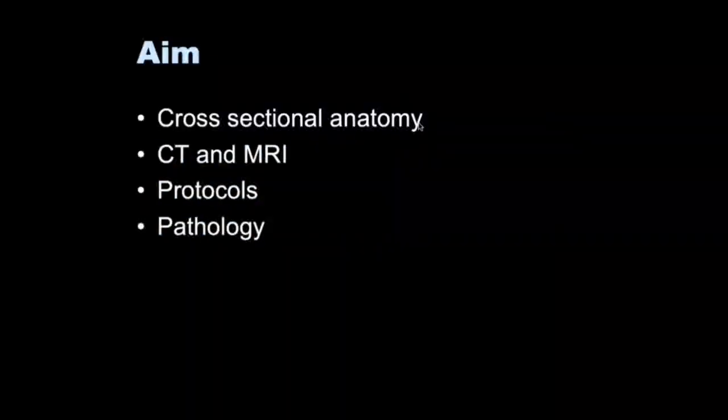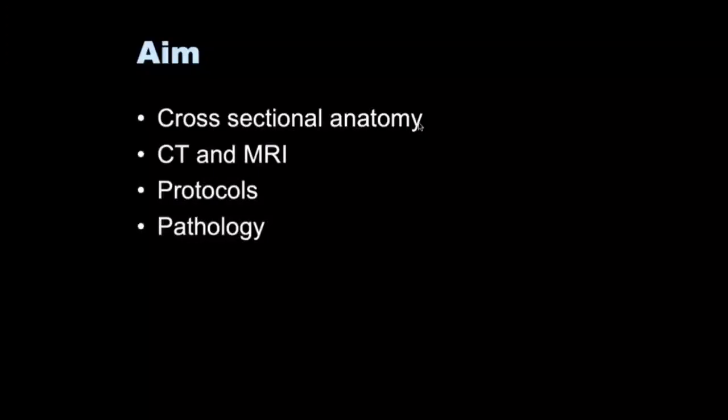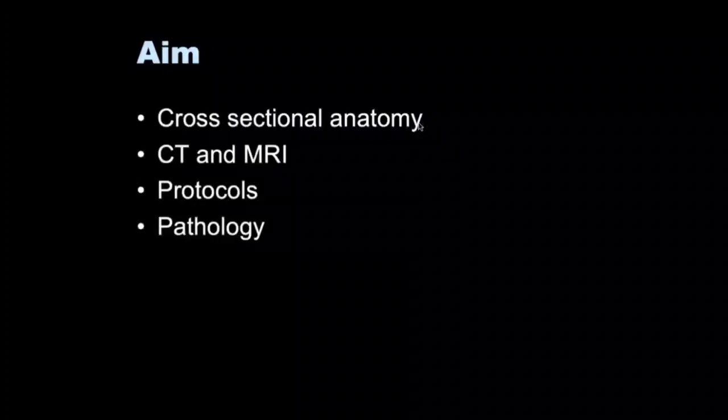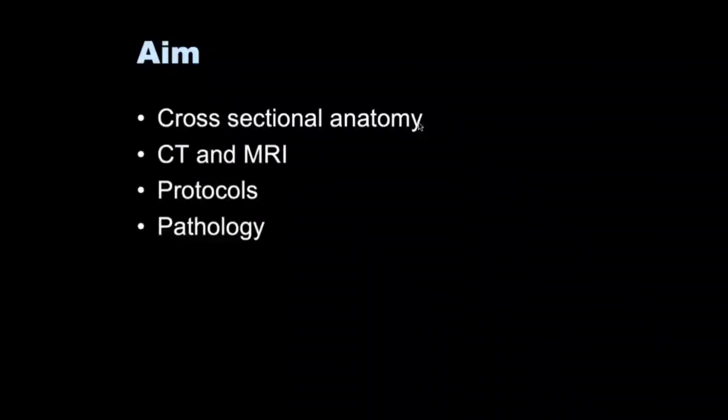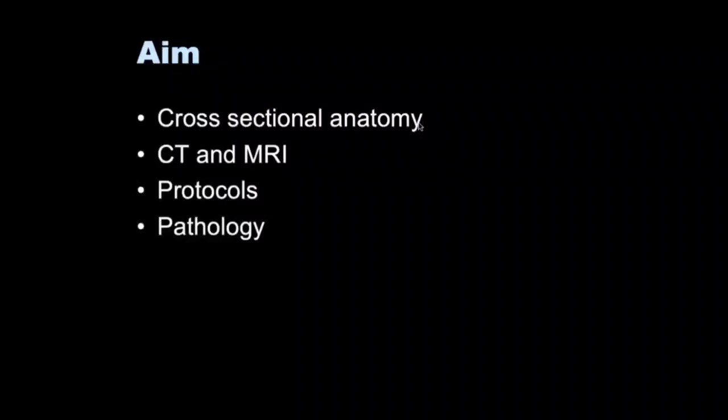I have nothing to declare, and in the next, say, about 30 to 40 minutes, we will be going through the cross-sectional anatomy of the spine, the various appearances of the CT and the MRI. We'll also be touching on the protocols, and then we'll be diving into pathology. Now, I do understand that there is a varied audience, and it might be a bit basic for some of the people, but it might just act as a good refresher for you.